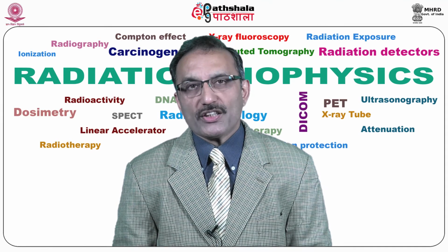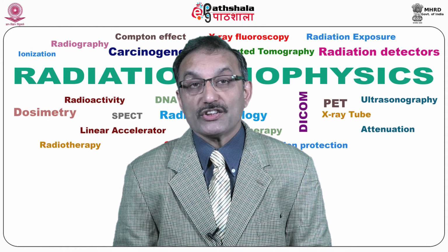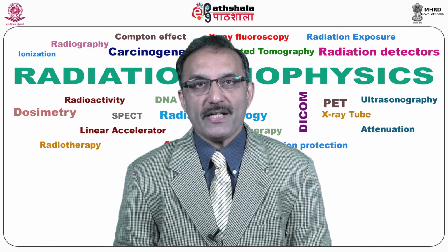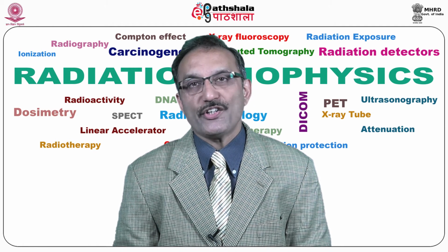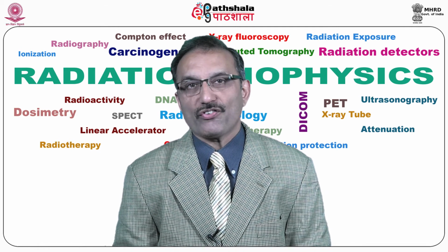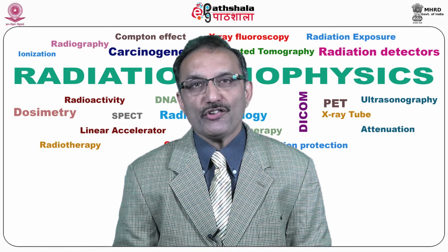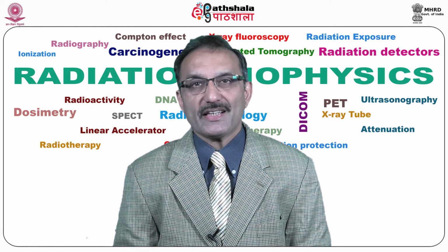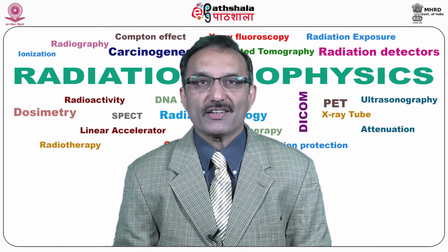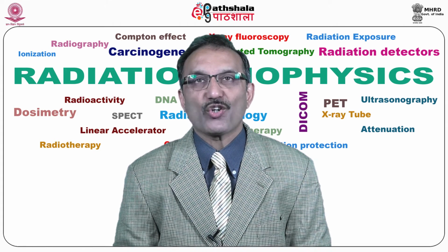When we talk about the introduction of this particular topic, the first thing which comes up is, what is nuclear medicine? Nuclear medicine is a branch of medical imaging that uses radiopharmaceuticals to examine the function or structure of organs and tissue. The main difference between nuclear imaging and other radiological tests is that nuclear imaging assesses how an organ functions, whereas other imaging methods assess anatomy.